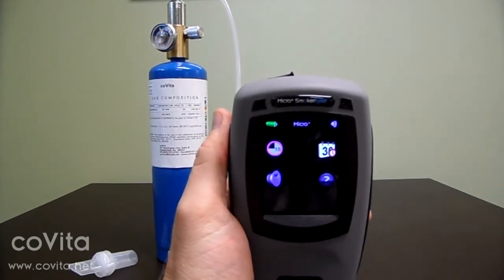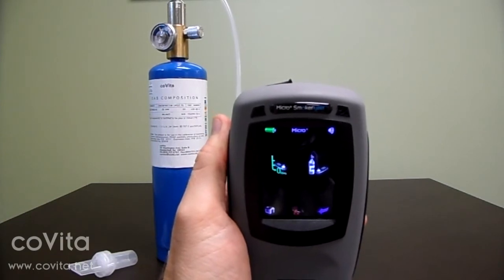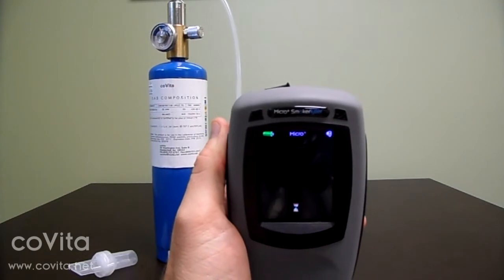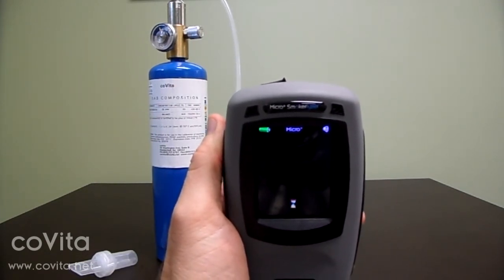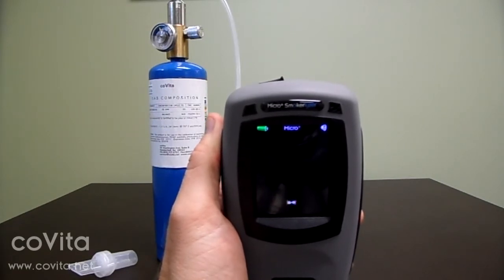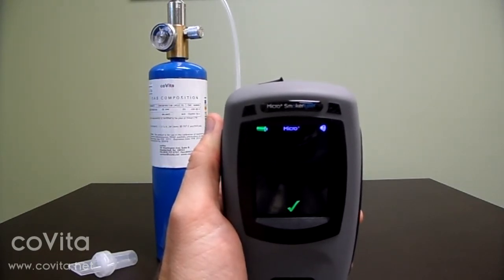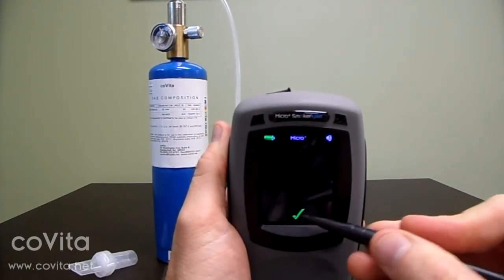Then, touch the calibration kit icon. Next, touch the zero scale. Let the zeroing process cycle through with the hourglass until you get the check mark.